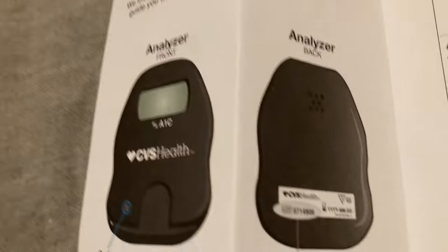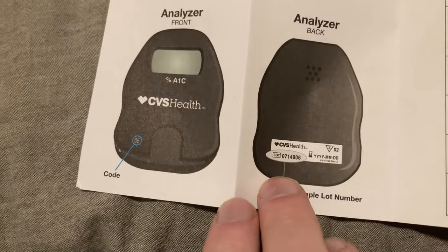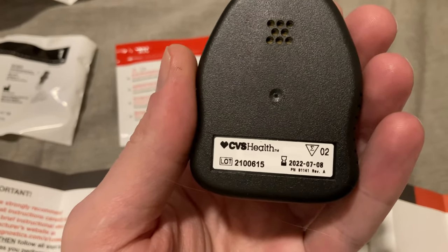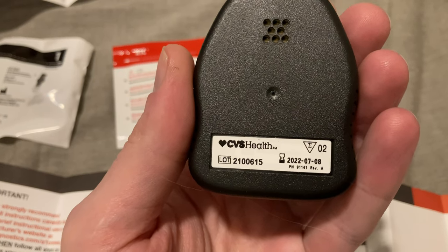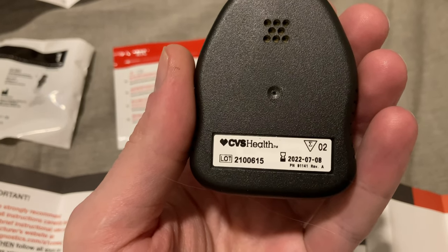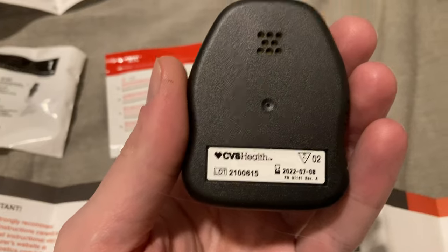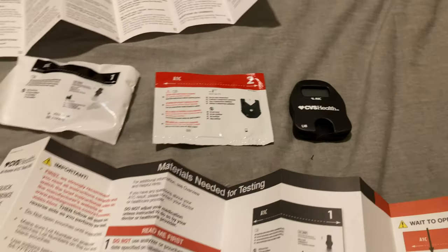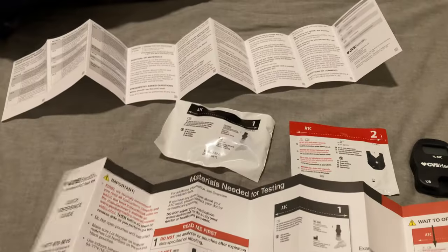You can see also that on the head unit, there's a lot number. So like on the back here, there's a lot number. And it tells you the expiration date. So 07/08 of 2022, this is no longer good. So I'm going to do my first one now and then again in a couple of months. So there's a deep dive of the instructions.